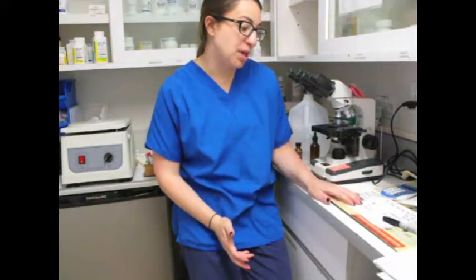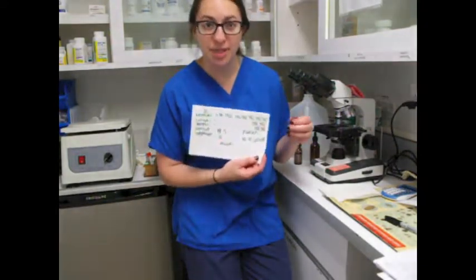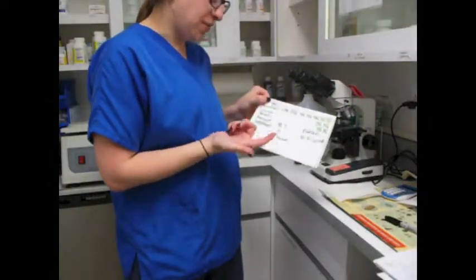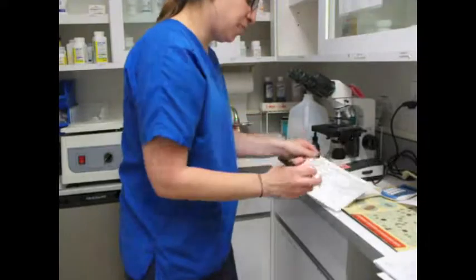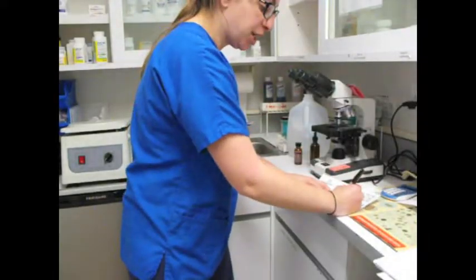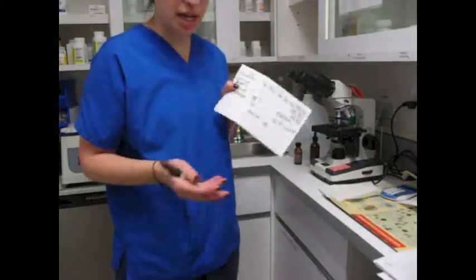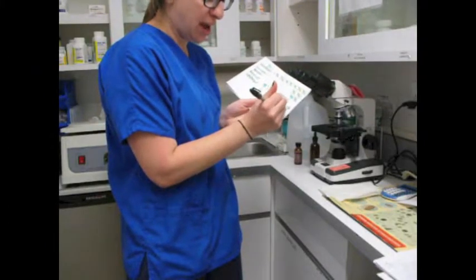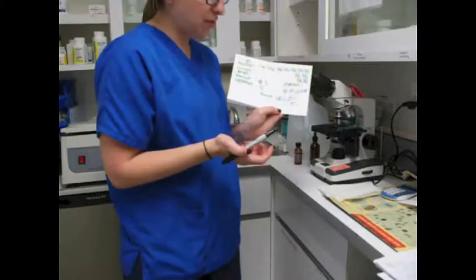So I'm just going to explain how I calculated the absolute values of these white blood cells. What you're going to do is you want to take the total white blood cell count times the percentage of the differential for each type of blood cell. So fairly straightforward. If there are 85 neutrophils, the absolute would be, there are 100 white blood cells total, which I counted, and then it'd be times the percentage, so times 0.85, which equals 85.